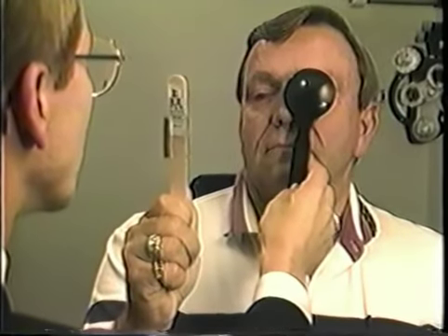I often have the patient hold a stick or card for this measurement because I need both of my hands to test. However, sometimes I have to use a little ingenuity when this is not successful, especially for the very young or inattentive patient. The third cover test, the simultaneous prism and cover test, is especially beneficial with small angle tropias when there may be a coexisting larger phoria.